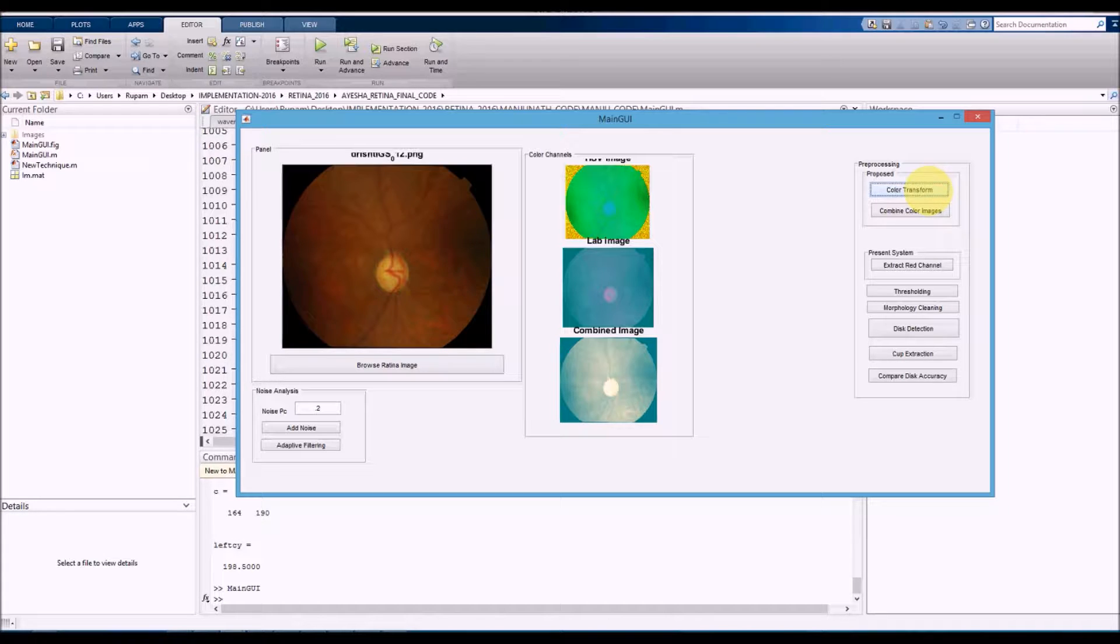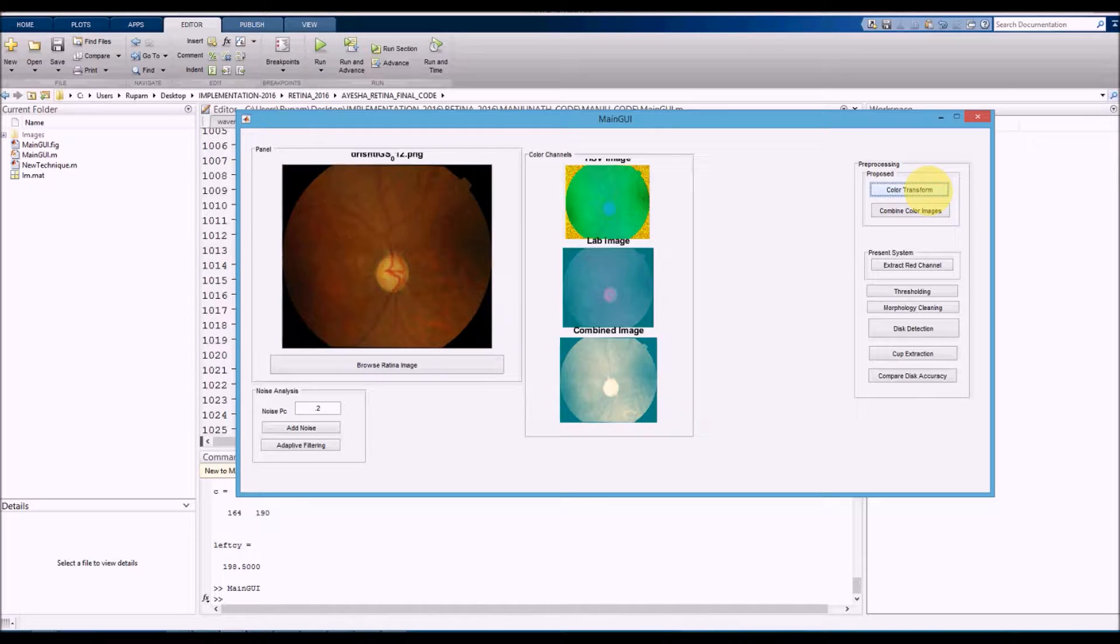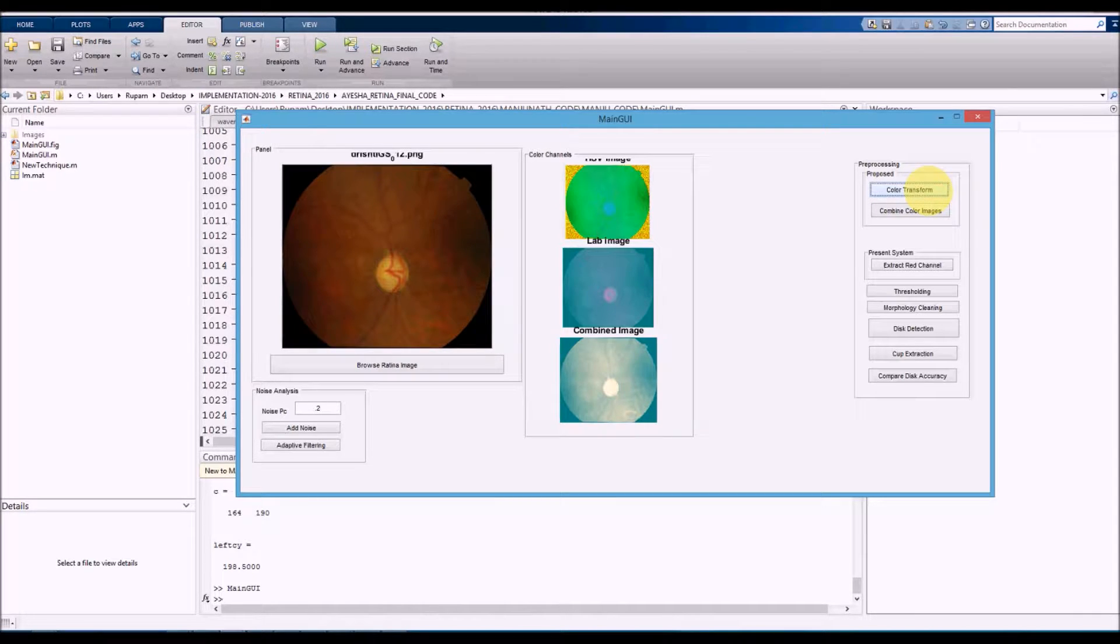If you combine LAB color space with HSB color space, you'll see an image where you can clearly see the disk area being highlighted.